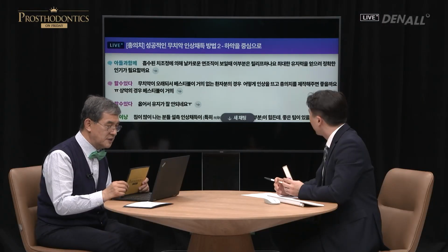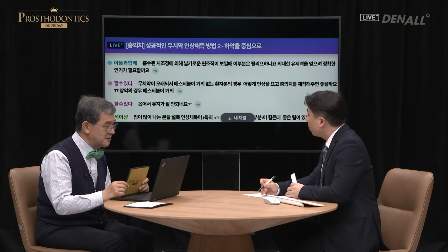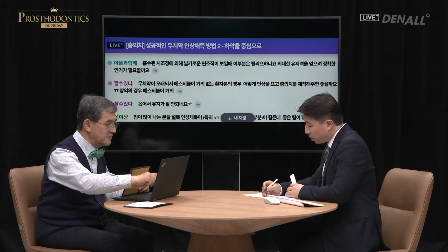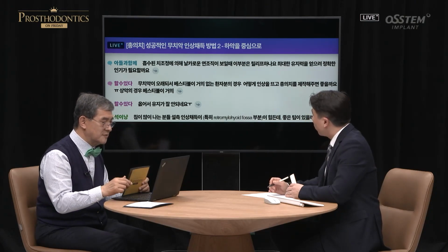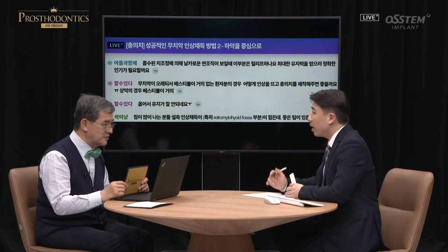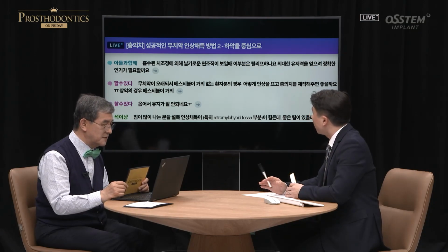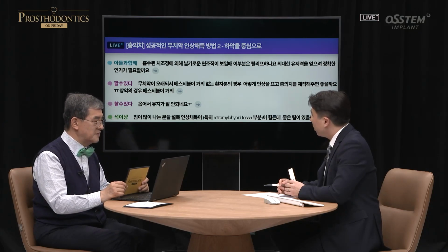If there is a sharp soft tissue, absorbed due to resorbed alveolar bone, do you do relief or do you register it accurately to get as much retention as possible? At times, when I do extraction, in the remaining area, if it is too sharp, as I do the extraction, I do bone flattening. If a denture is planned, a permanent soft liner can be used as well.